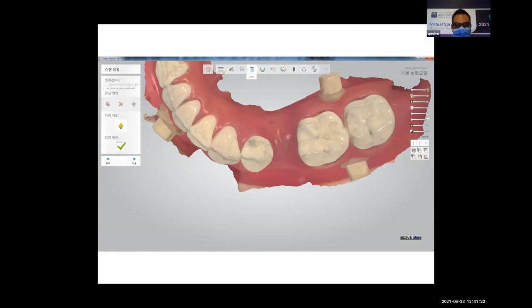At the surgical session, the surgeon inserts the implant in the proper position, as he knows that is the best place. And after some months, the patient is referred to the prosthodontist for prosthesis. So this type of surgery or implant treatment is called surgical driven implantology. But in the newer concept, we do implants in a prosthetic driven manner.